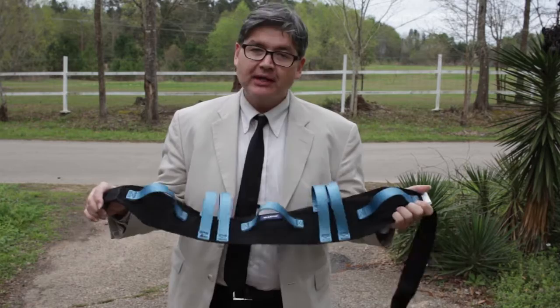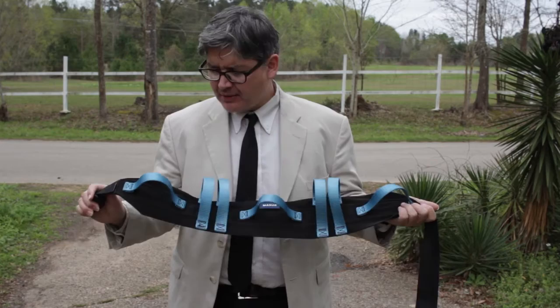Hello, today I want to talk about something called a gait belt — a GAT belt — and this belt helps people with mobility issues. So if you're older, if you got injured, this is something that helps you with mobility.